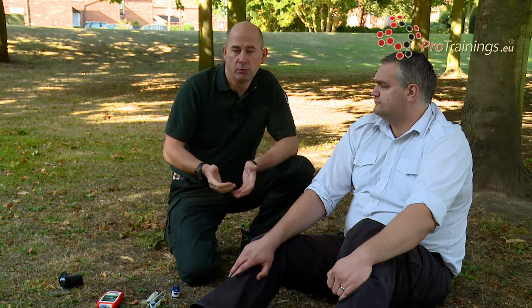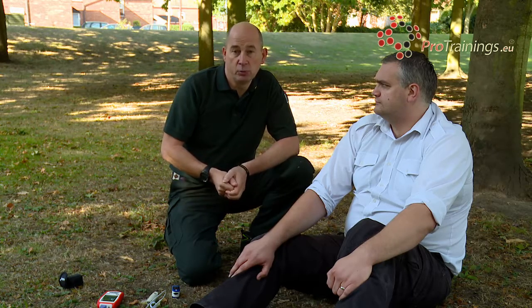What is their actual condition, and what signs are they showing us to say that they have an oxygen problem or a breathing problem? Is there any muscle damage? Are there any fractures or any holes in the chest? We cover all that in another video. Now we're going to actually have a look at the pulse oximetry itself and how we use it.